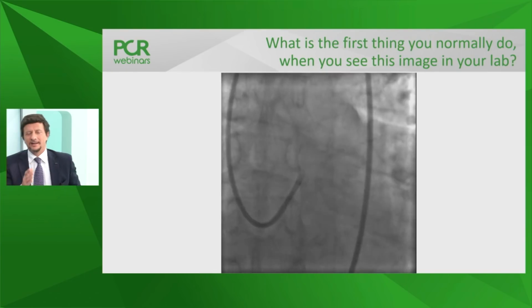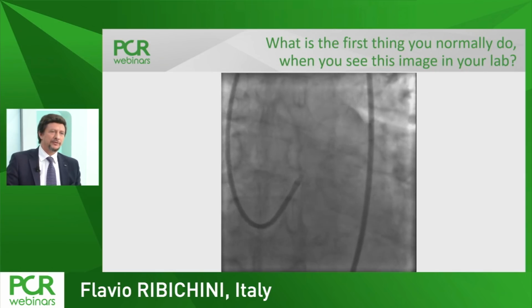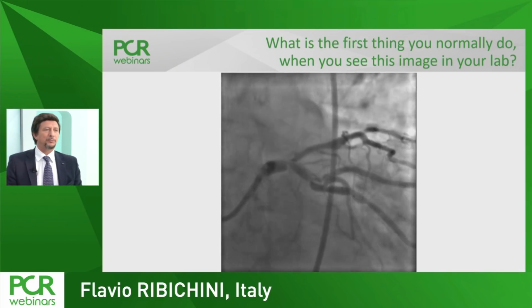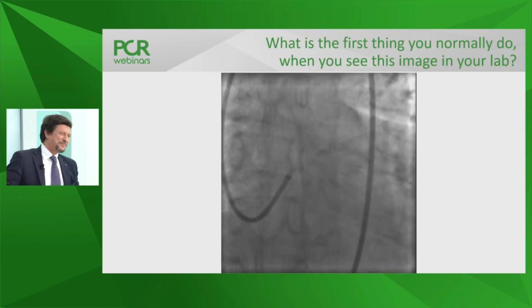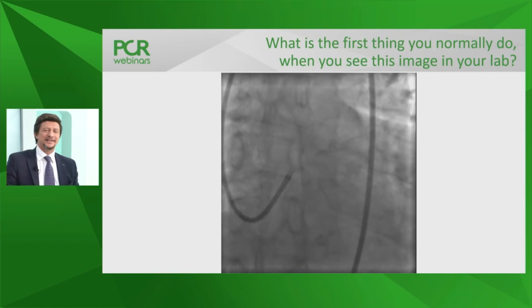Well, the first reaction I have when I have in front of the screen such an ugly image of a tight lesion of the left main is looking at the monitor and checking the blood pressure and the heart rate of the patient. And then if everything is fine and normal, I look at the patient, I smile to him and try to make things calm and easy.